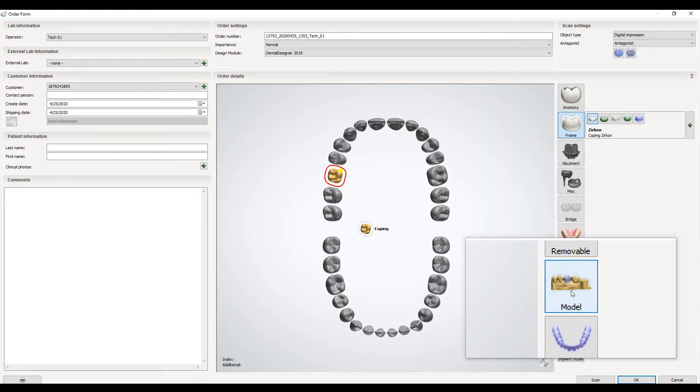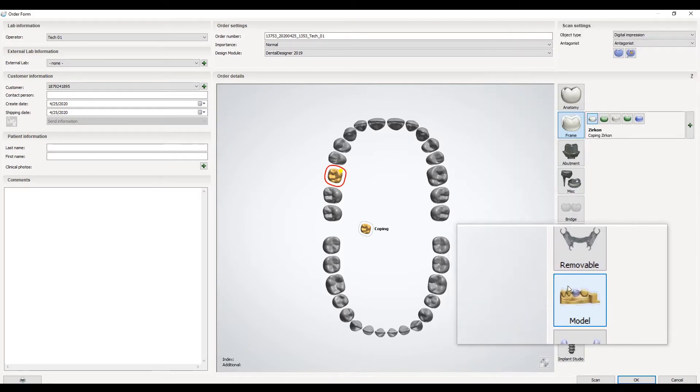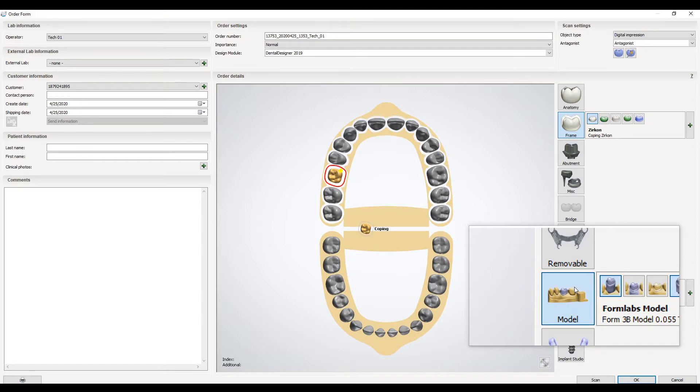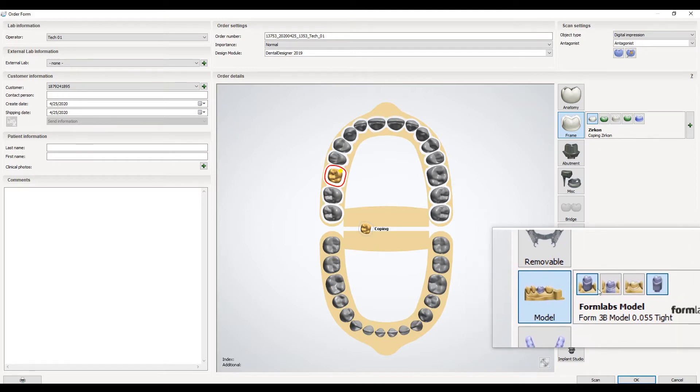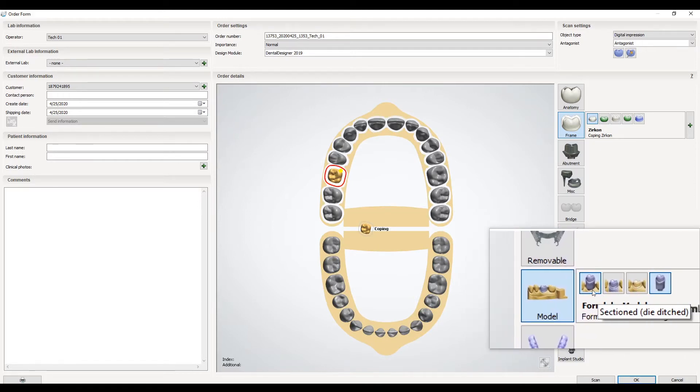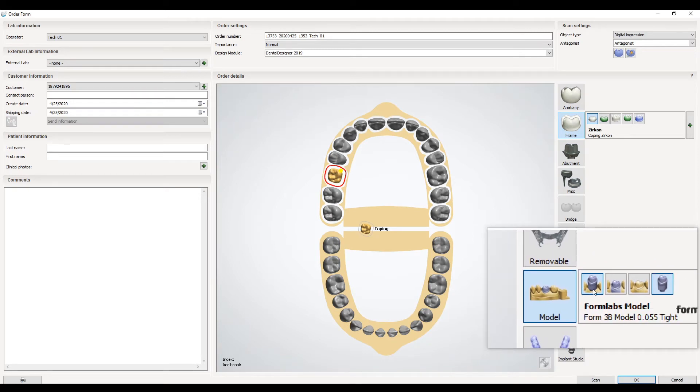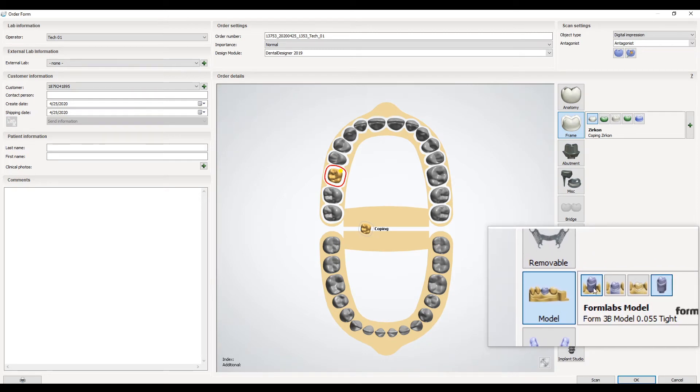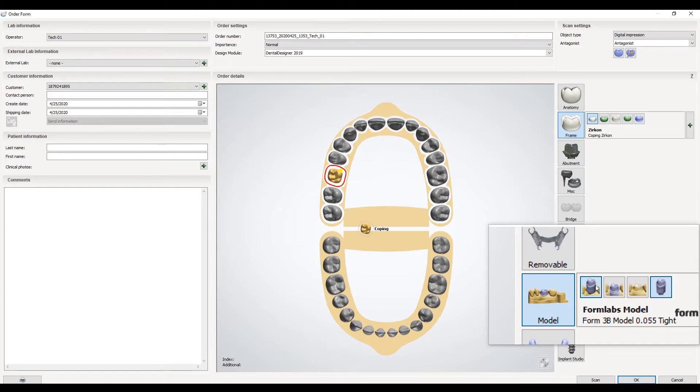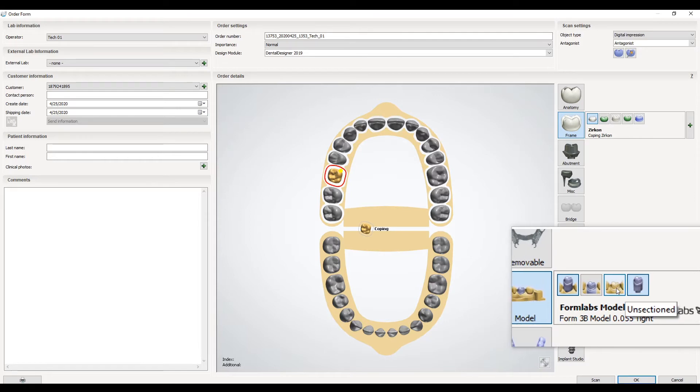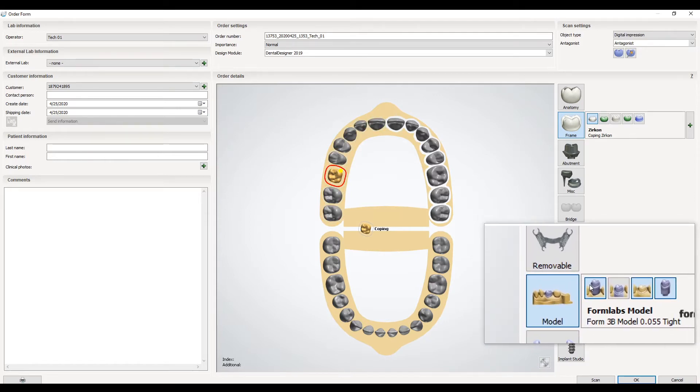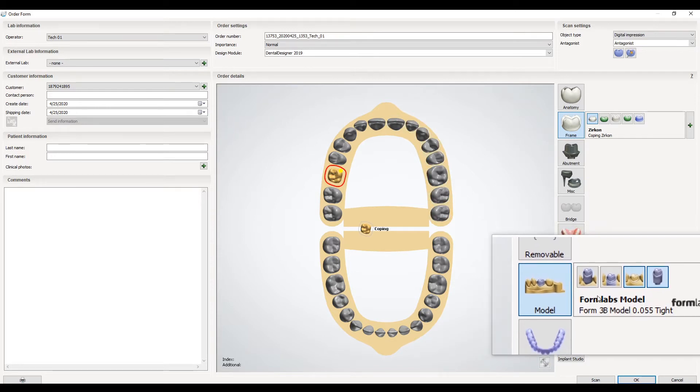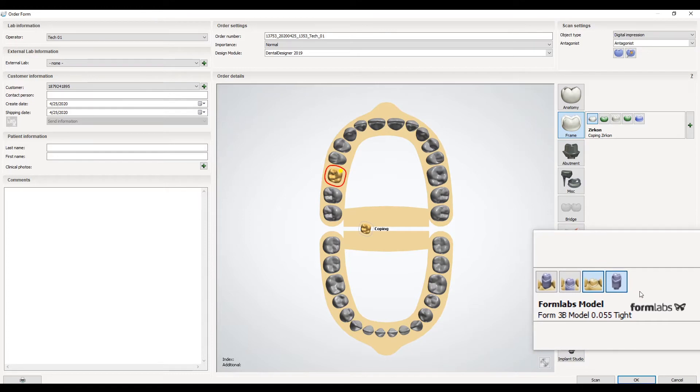Once digital impression is on, we want to click the model button with a tooth selected. It comes in default with removable dies as the selection. This button here indicates that it's a removable die and this button indicates that it produces a die at all. For solid dies we want to click on this unsectioned button and turn off removable dies.